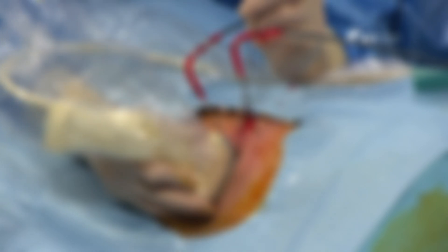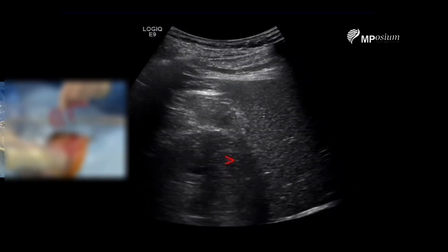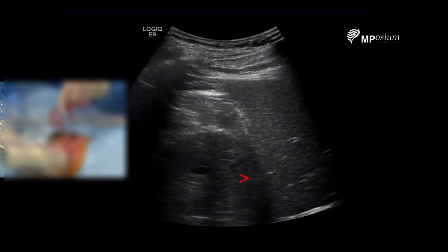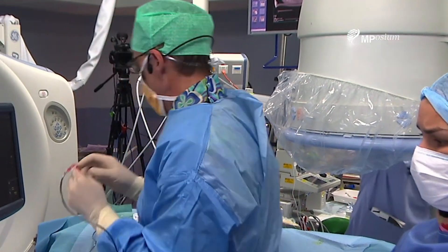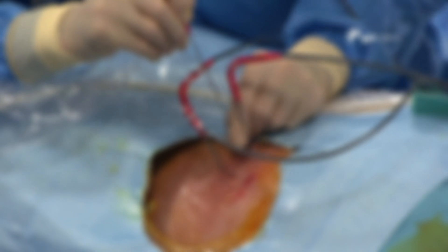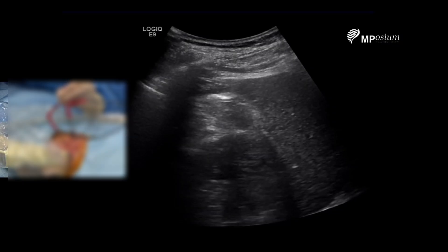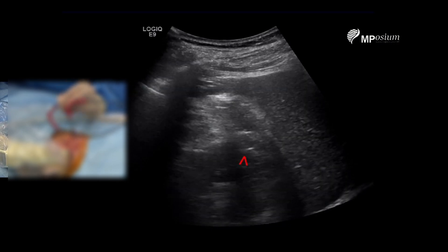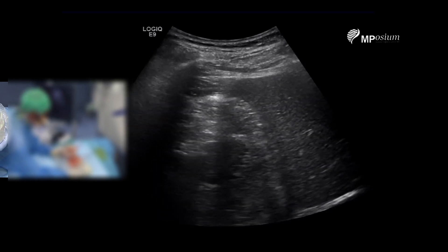I will give a 20% freeze to this probe as well. I will now try to place needle number three to the external and medial part of the tumor. Here is the frozen part and here is the part we want to reach. This probe is reaching the medial and external part of the tumor. I will stick needle number four to the medial and internal part of the tumor. I am not freezing the first needle because it is close to my probe — if I freeze it I will not be able to see my target. You can see the needle is a bit too lateral so I will redirect to be more medial, now going down to the more medial aspect of the tumor.